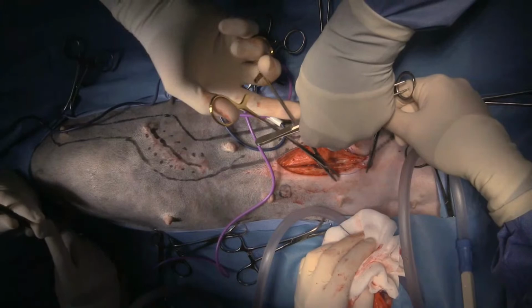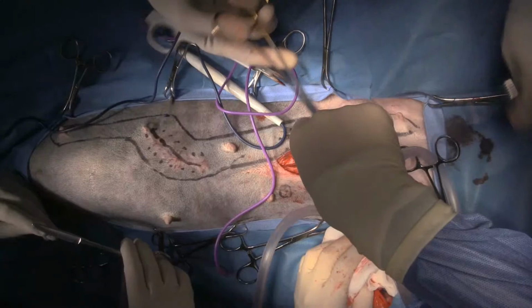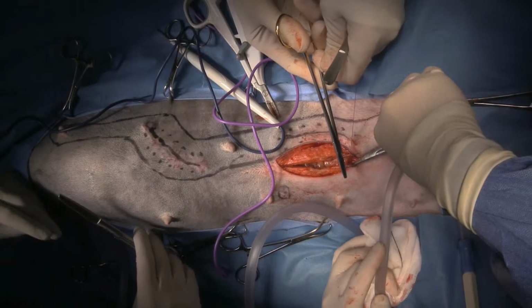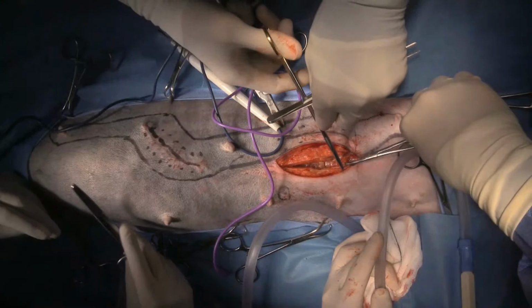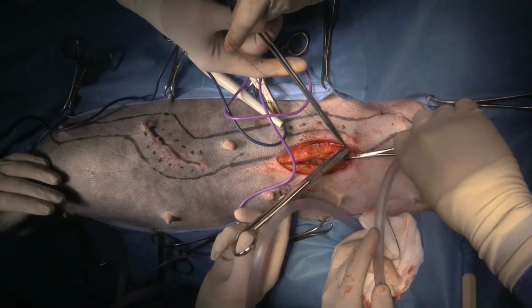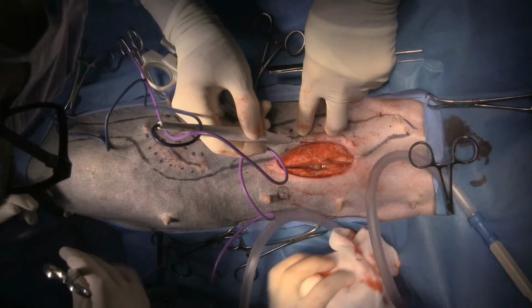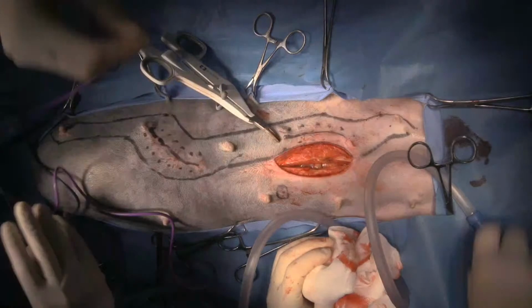So there you go. Give us a nice ligature. Okay, and up and over. Okay, and then release slowly. And then we re-grab. Okay, re-grab. And nice. And release, please. Thank you. And lap sponge, please. All right, so now when we close the abdomen, I missed the linea, so I only have to get external rectus fascia.